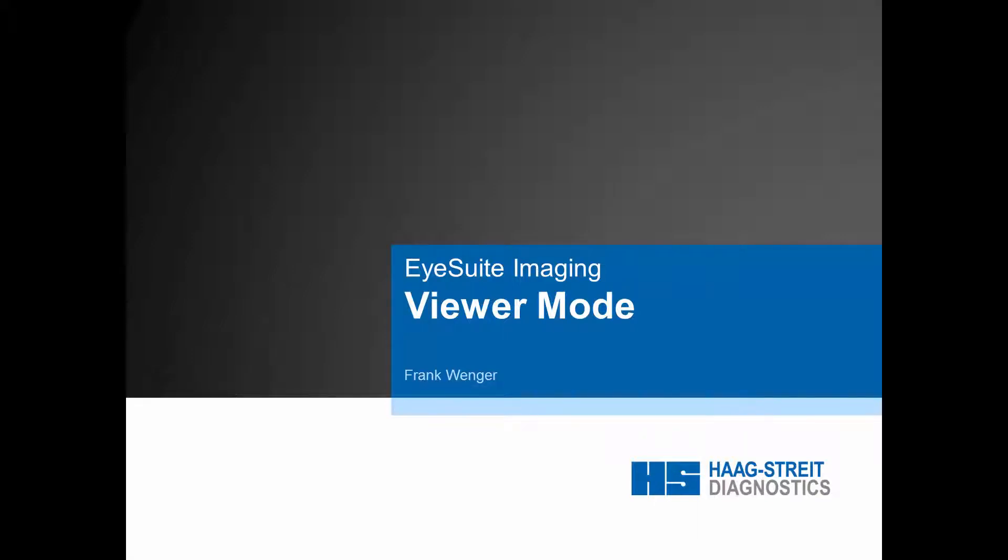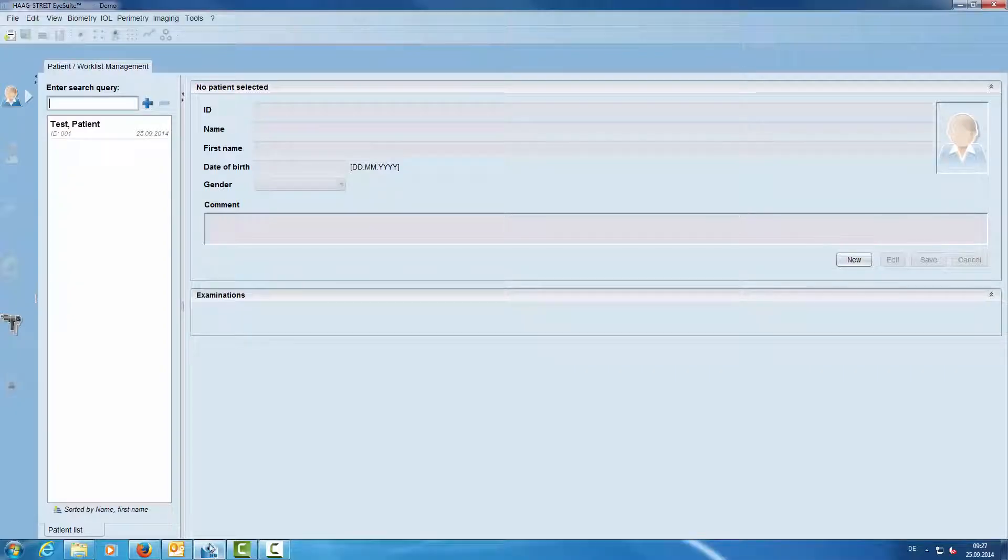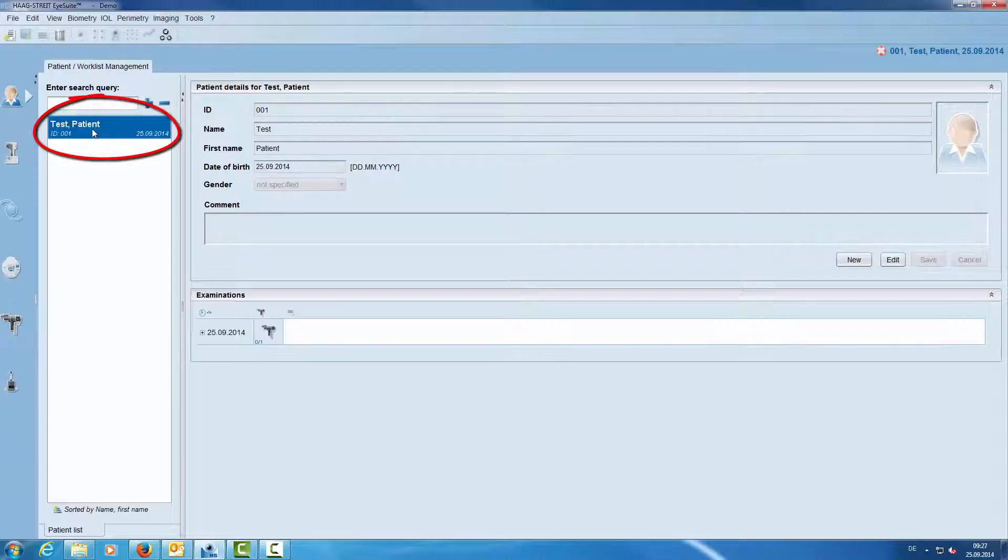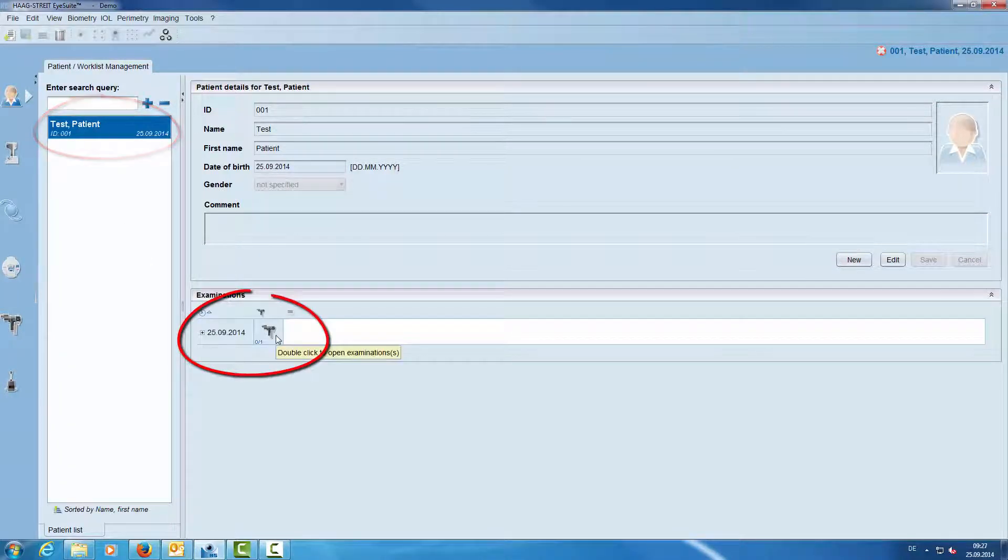This video explains the viewer mode of iSuite imaging. First we open iSuite, then we select a patient and open an examination with a double click.